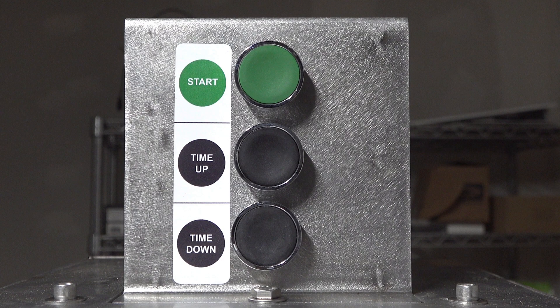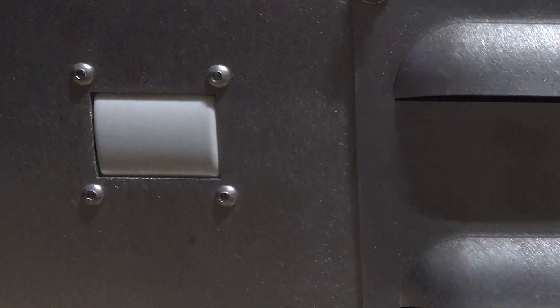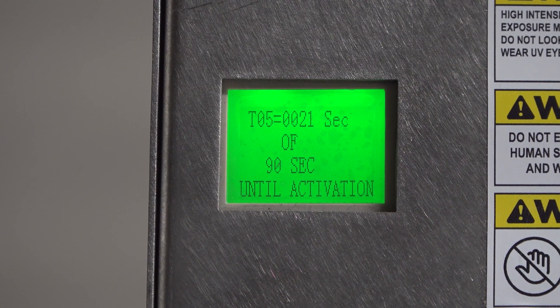These lights are available with digital timers that allow the user to set the disinfection time, safety motion sensors that shut off the light when motion has been detected, and a 90 second startup delay that allows time for clearing the room before activation.